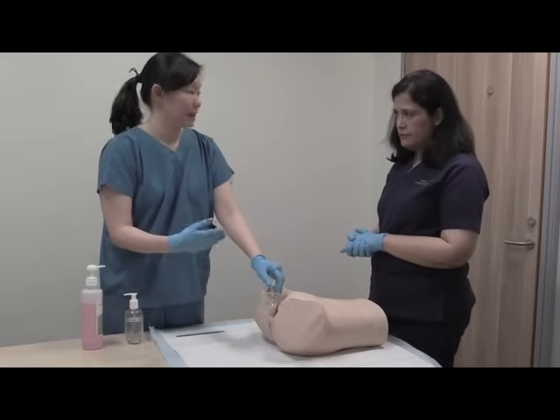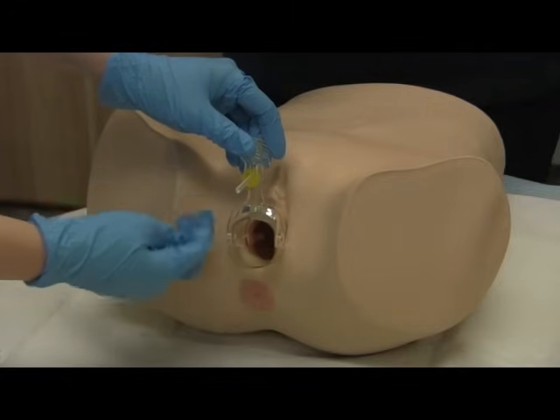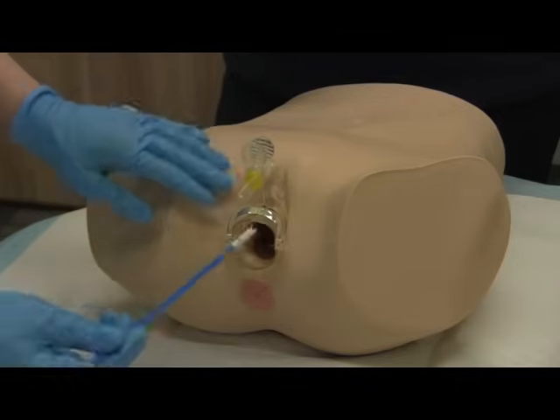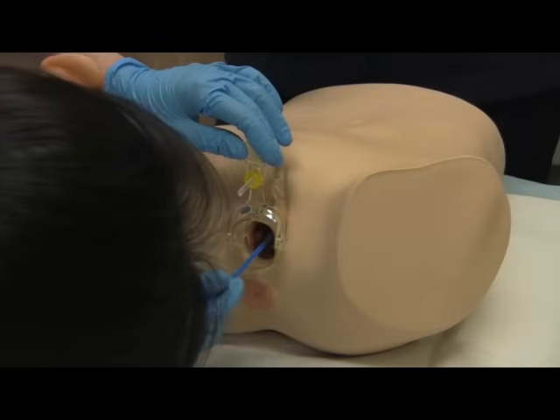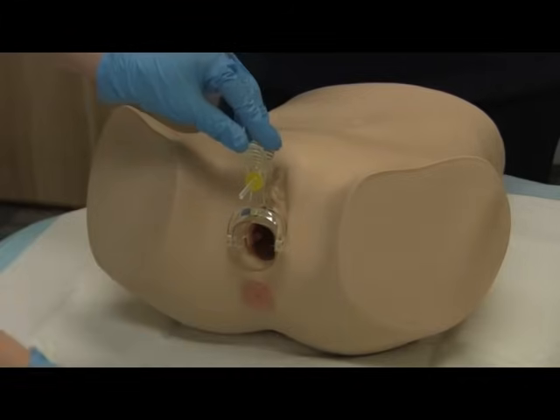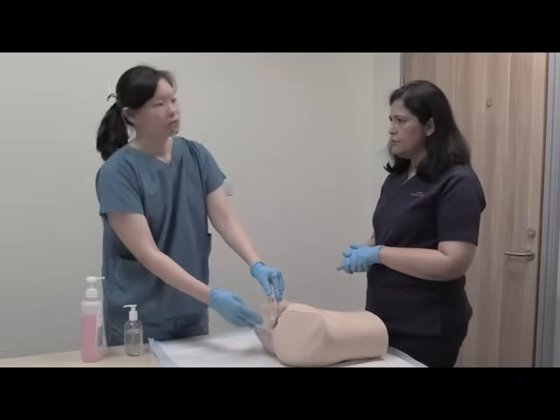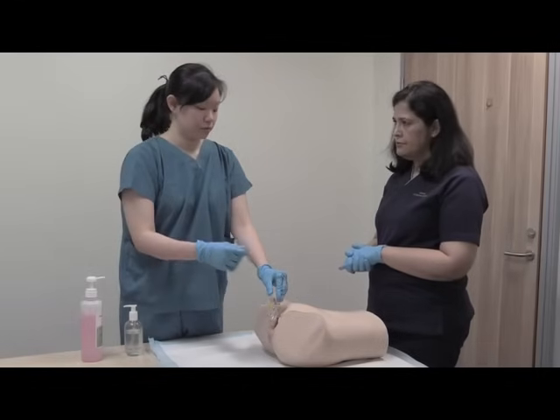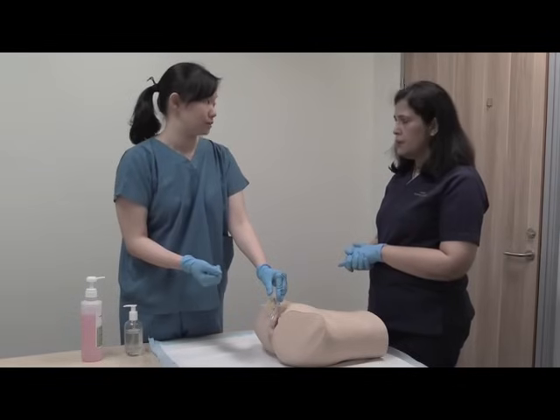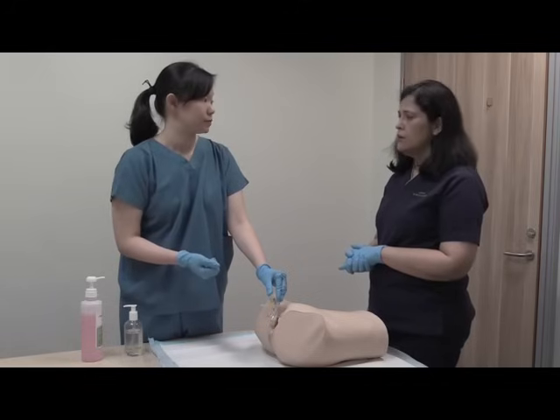Next I'll move on to do a pap smear. I can turn the knob here to make the speculum self-retaining so that I can free up one hand to perform the pap smear. I visualize the cervical os and perform the pap smear. At this stage we can also perform vaginal swabs if there's evidence of discharge or suspicion of vaginal infection. If there's an indication for endometrial sampling, this is also the time to perform it.